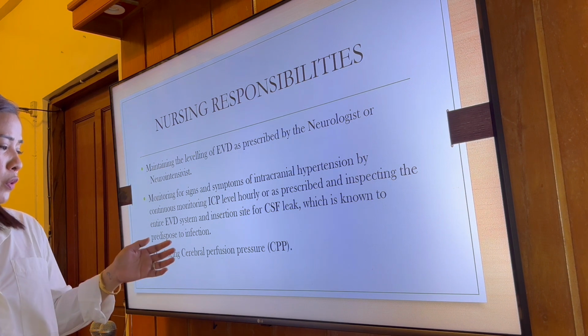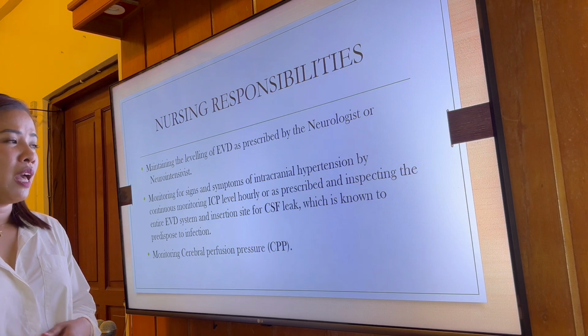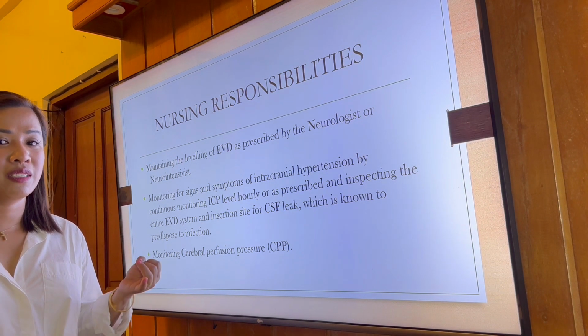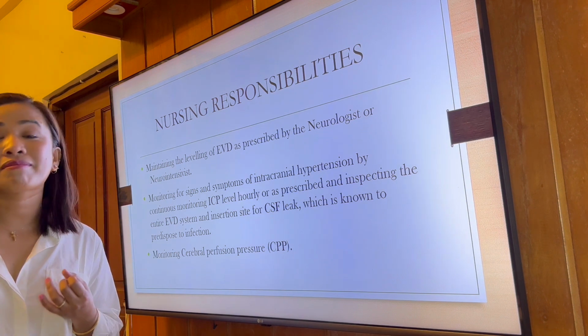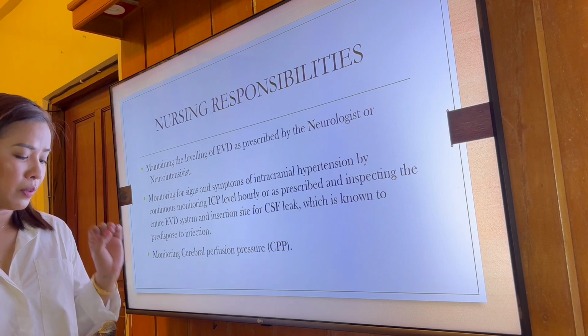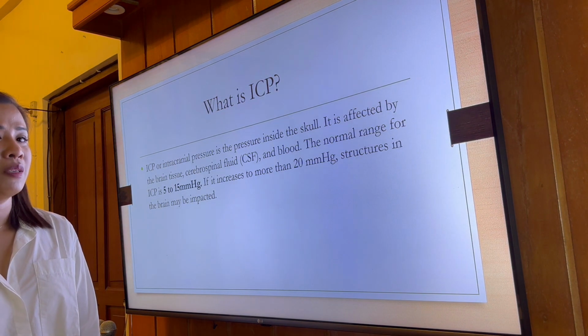Monitoring cerebral perfusion pressure is also one of our responsibilities. And I forgot to include that we also need to monitor the patient's pupil reaction, pupil size, and yeah.